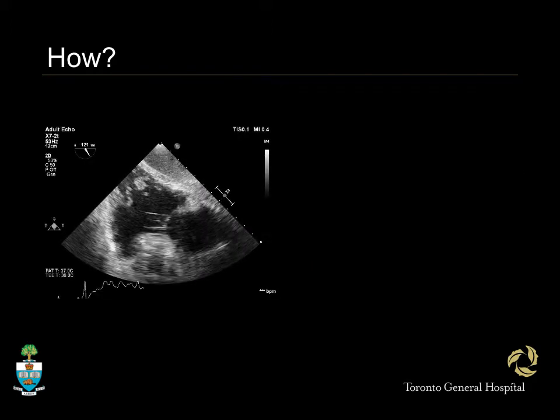So how do we measure strain on the right ventricle? The first attempt to measure strain, and the first technology that allowed measuring strain, was based on tissue Doppler. There's a nice feasibility paper published by Claude Toussignan, one of my colleagues from another hospital in Toronto, a few years ago in Anesthesia and Analgesia.